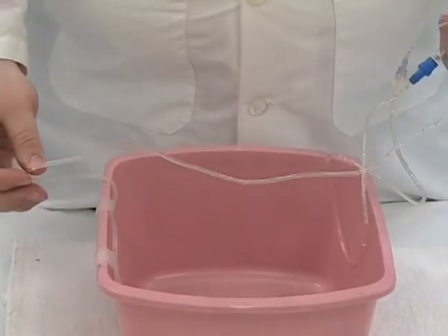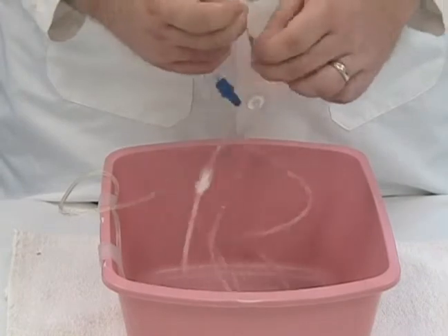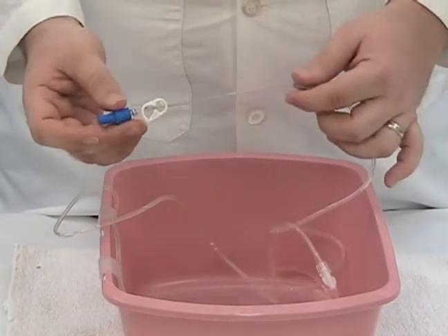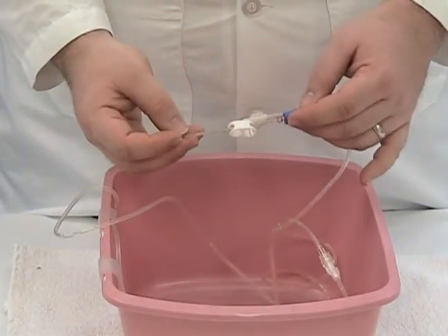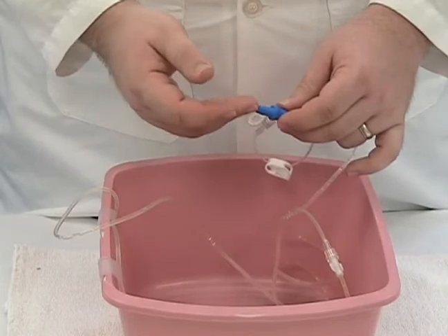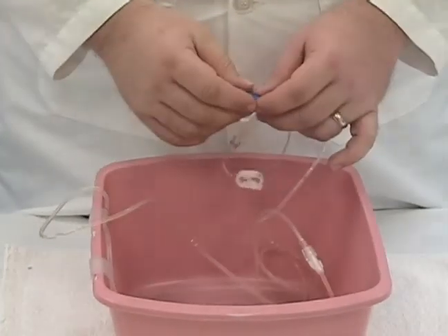This is an IV fluids drain that we created at the request of our nursing programs. We taped IV tubing to the inside of a large emesis basin. At the end of that tubing, there's an extension set. During the simulation, this extension set is then coiled and taped to the arm of the mannequin to represent a peripheral indwelling IV. The port of the extension set can then be used to push medications or IV fluids through that is collected into the drain.